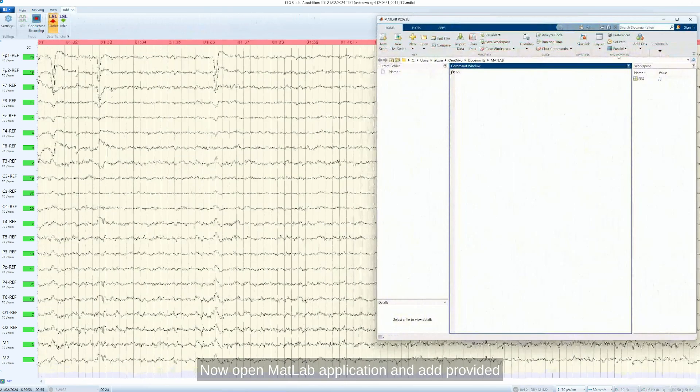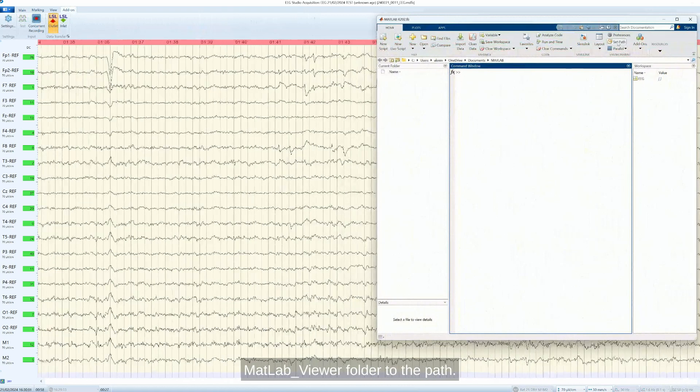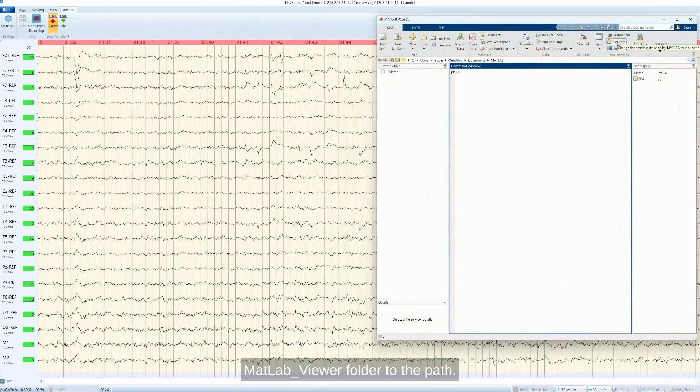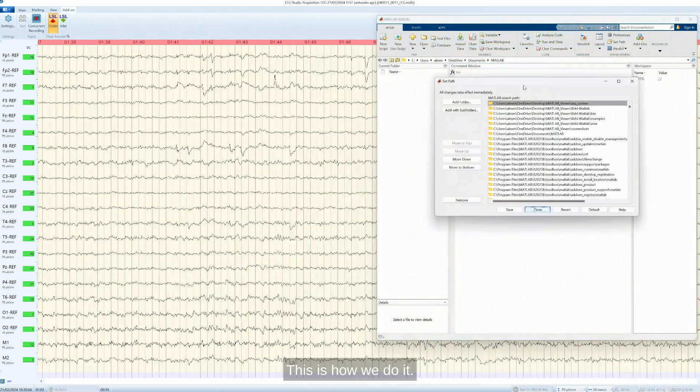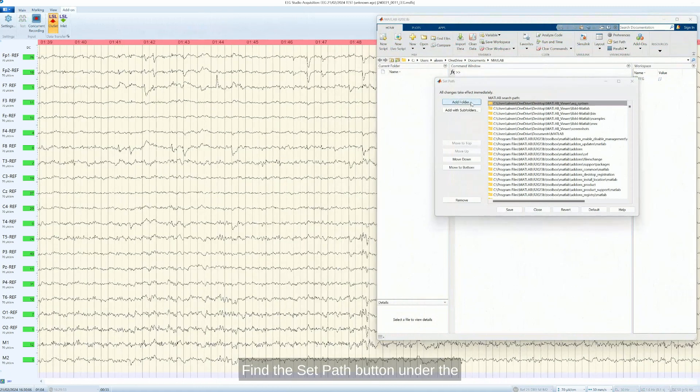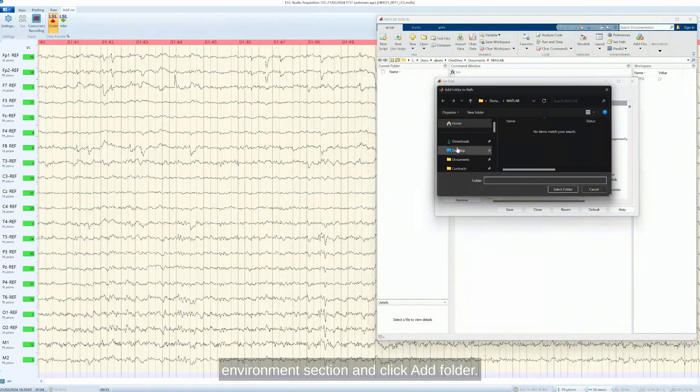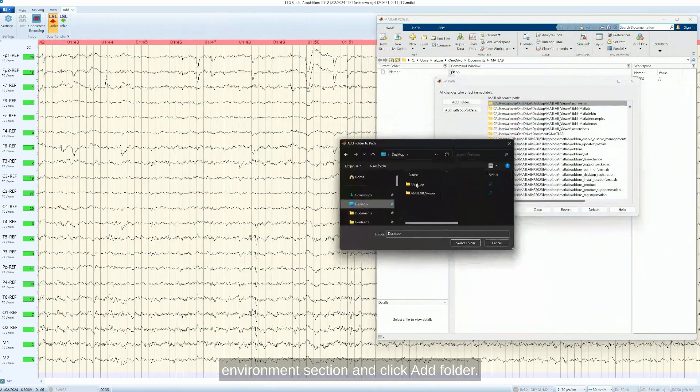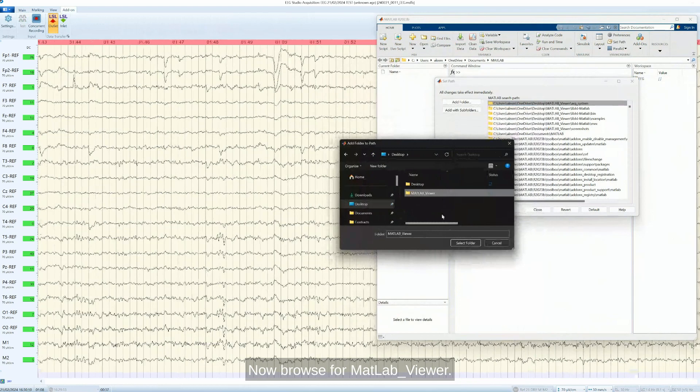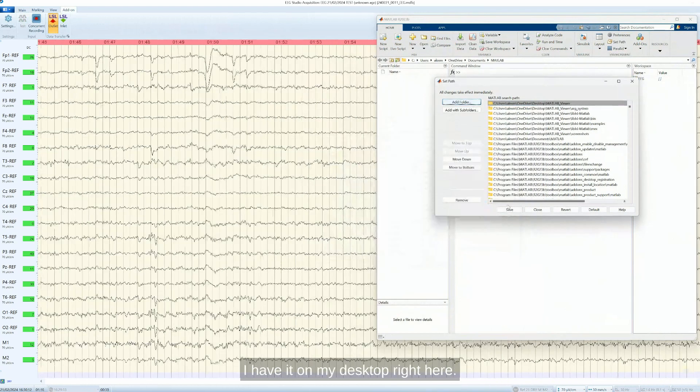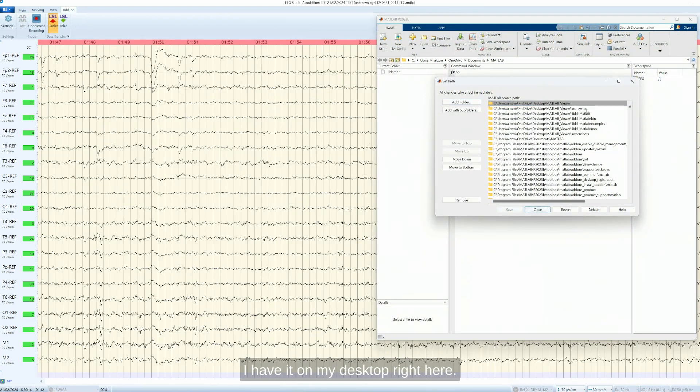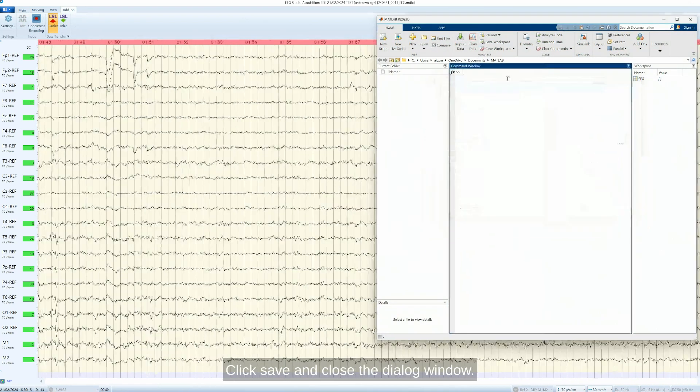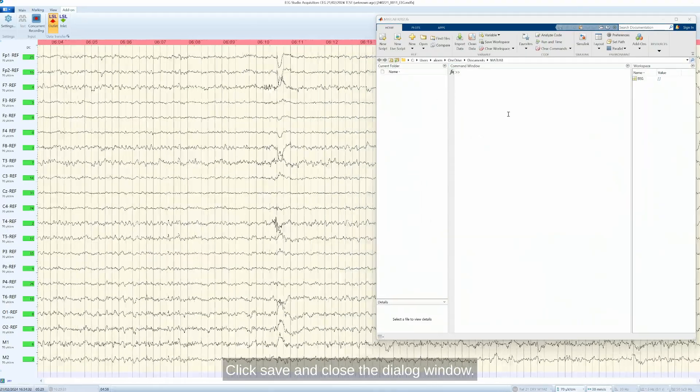Now open MATLAB application and add provided MATLAB Viewer folder to the path. This is how we do it. Find the Add-Path button under the Environment section and click Add Folder. Now browse for MATLAB Viewer. I have it on my desktop right here. Click Save and close the dialog window.